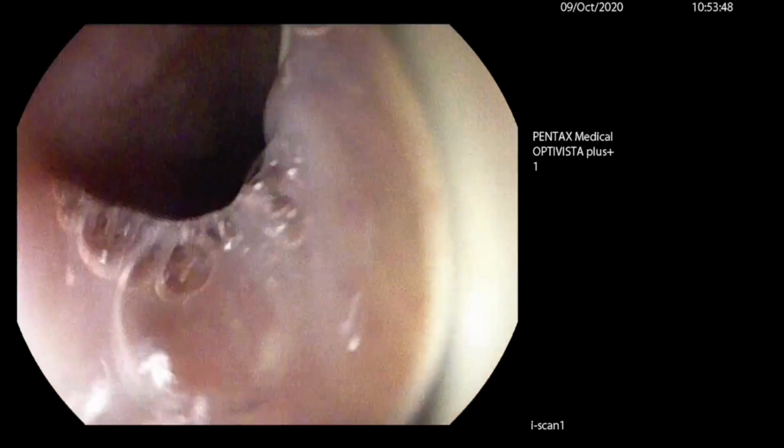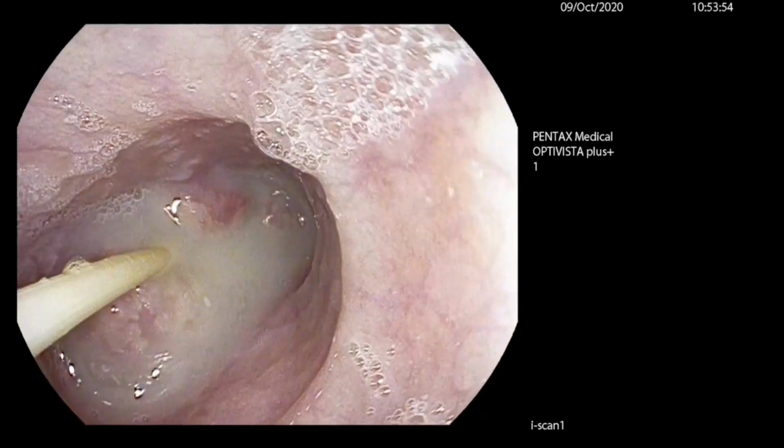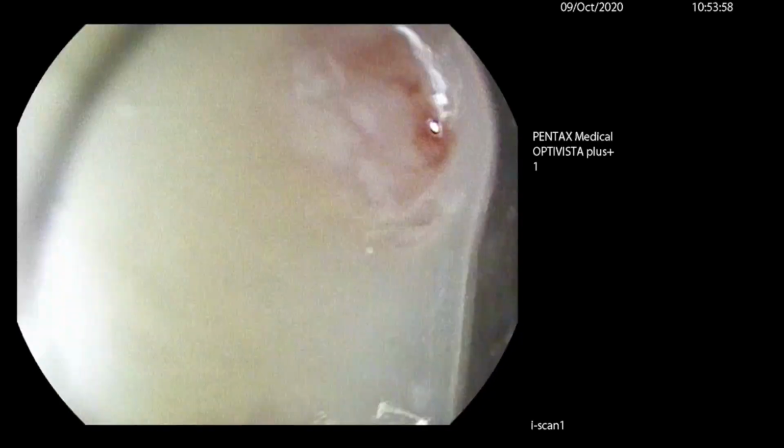Upon intubation into the esophagus, the first thing you can identify, in addition to the feeding tube, is a large column of liquid above what looks like a polypoid tumour. So I think at this stage, my first priority will be to aspirate and suction out as much of this liquid to avoid the risk of the patient aspirating.